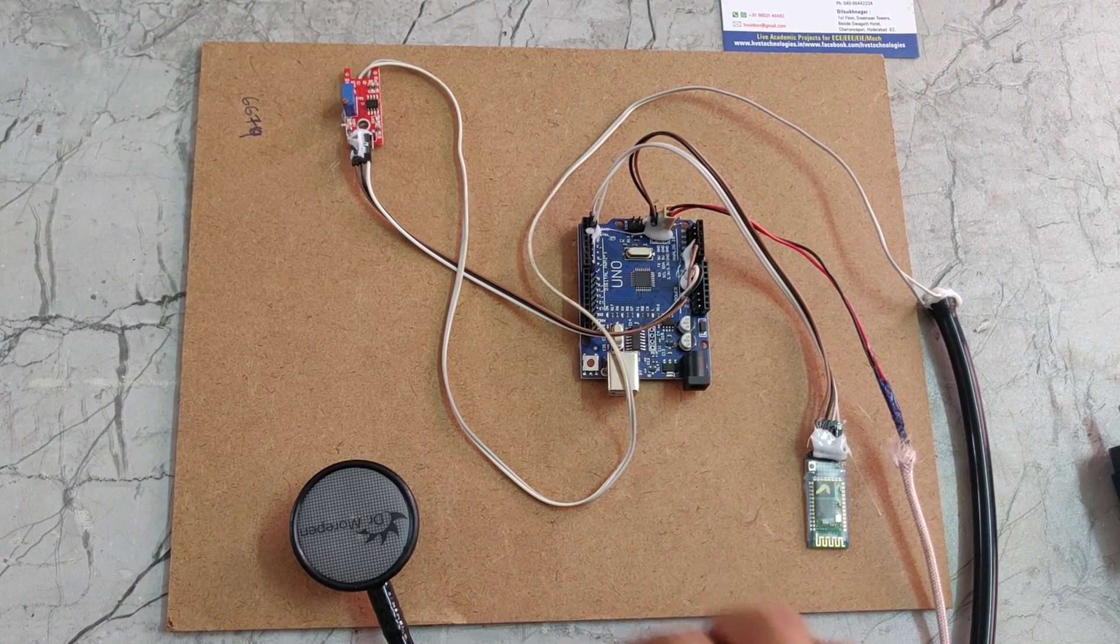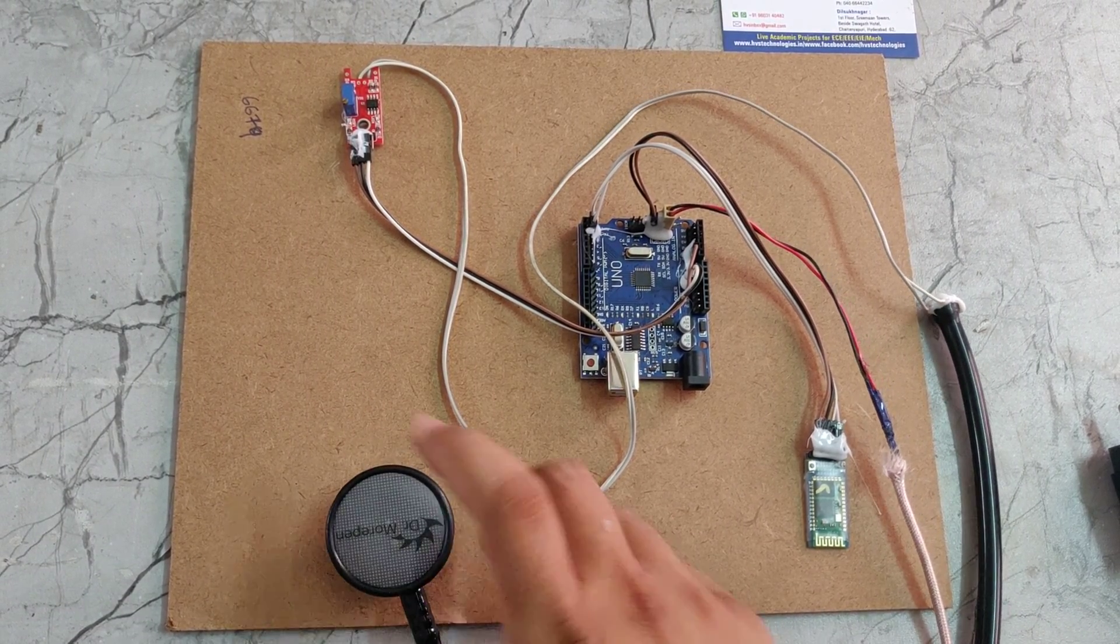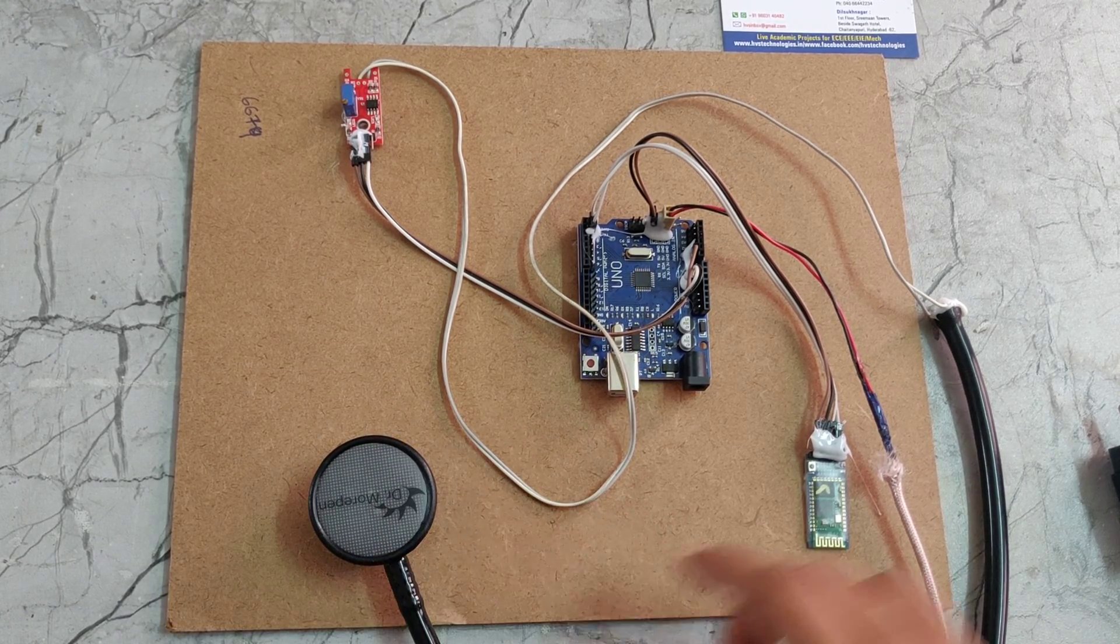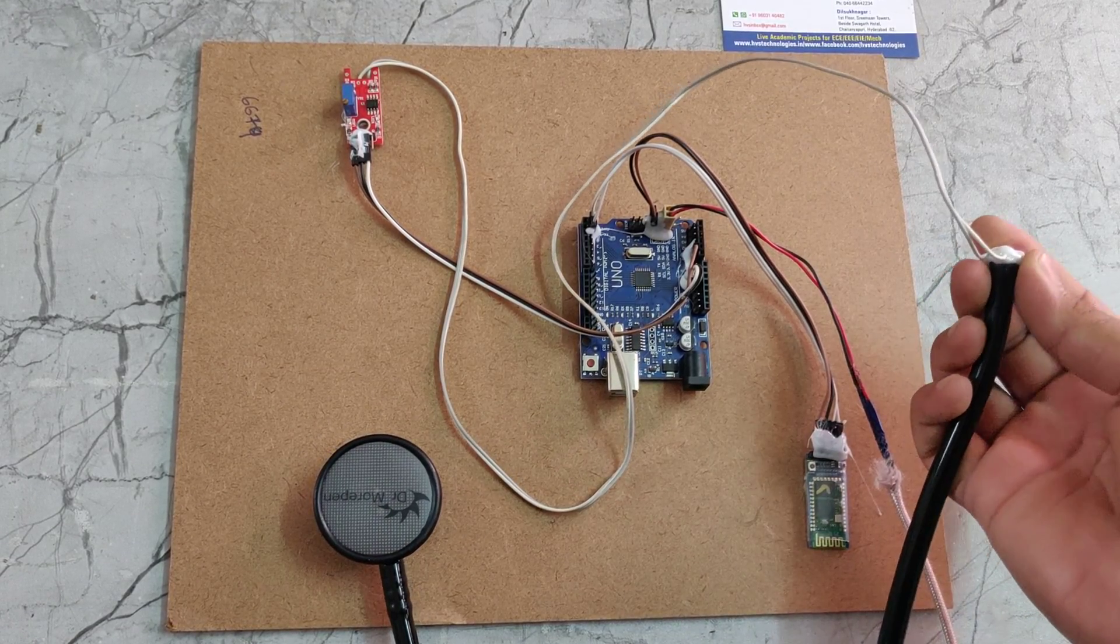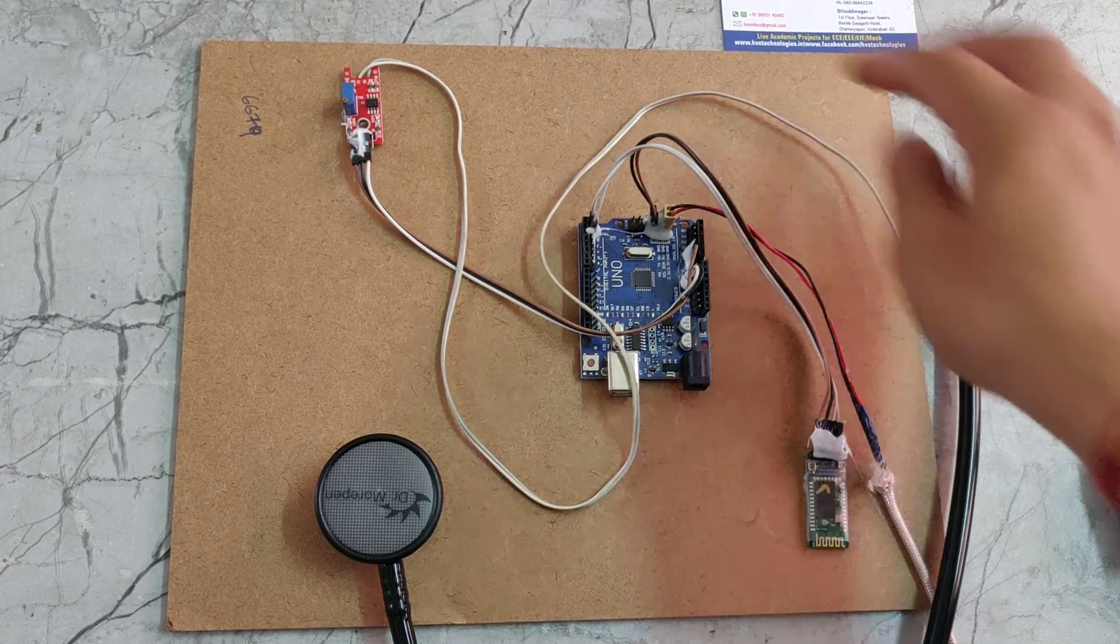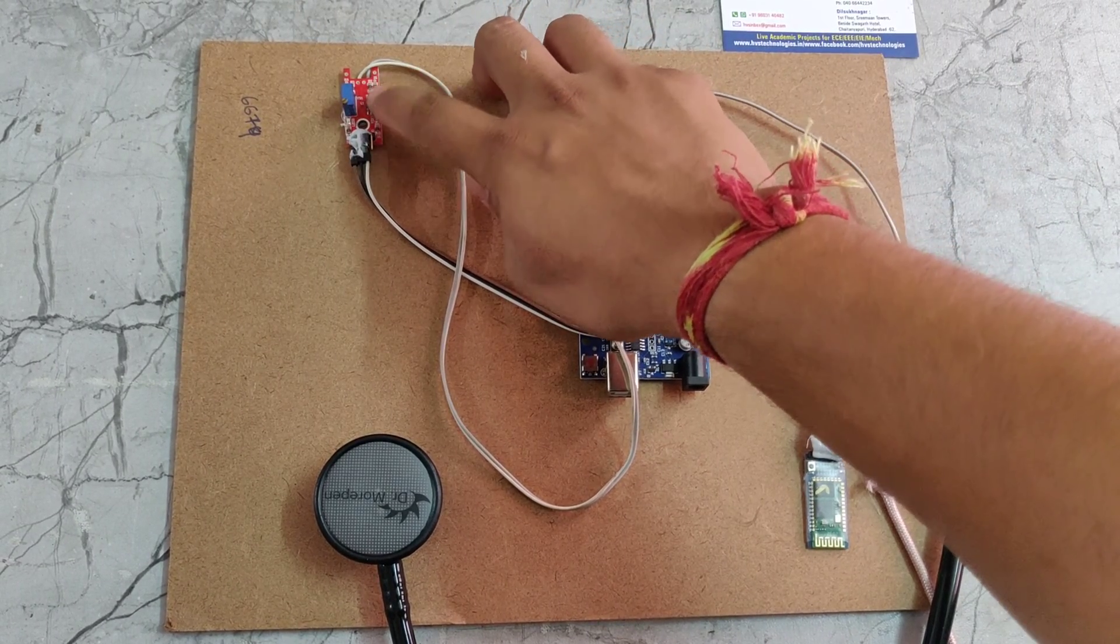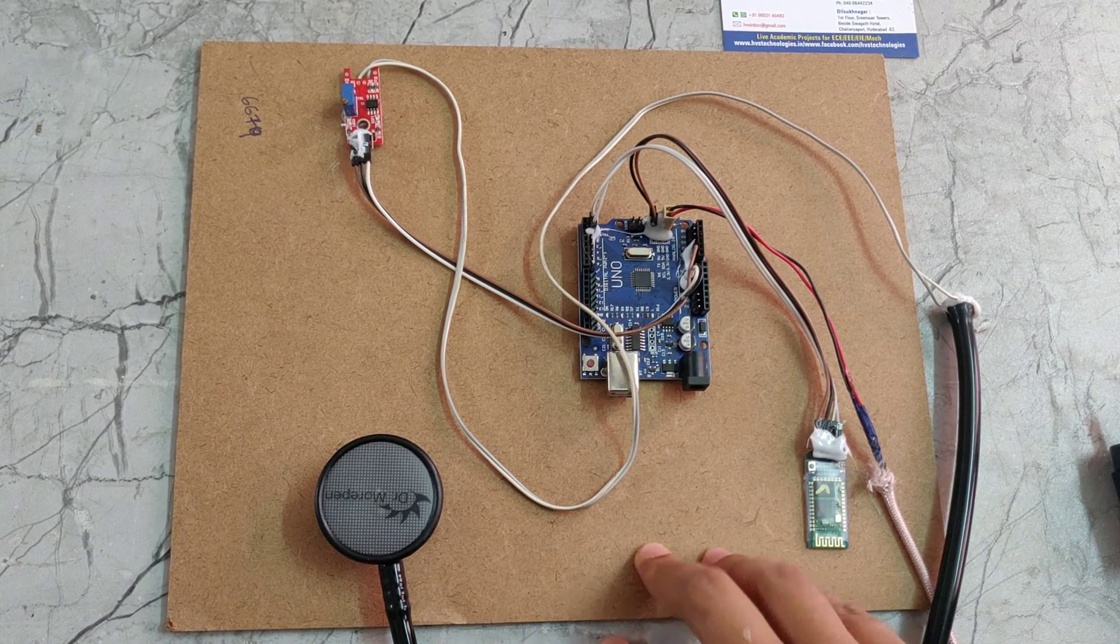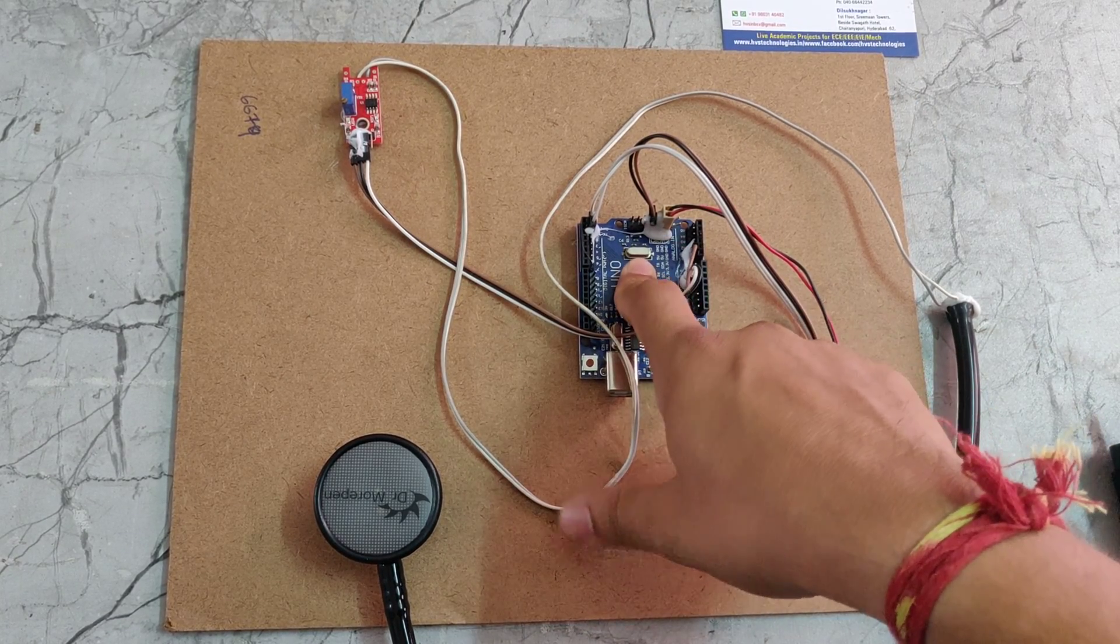We don't provide any power supply for the stethoscope. It will observe the sounds. The sounds will be calculated by the sound sensor mic, then sent to the sound sensor amplifier. The amplifier will amplify the signal. That amplified signal will be given to this Arduino Uno.